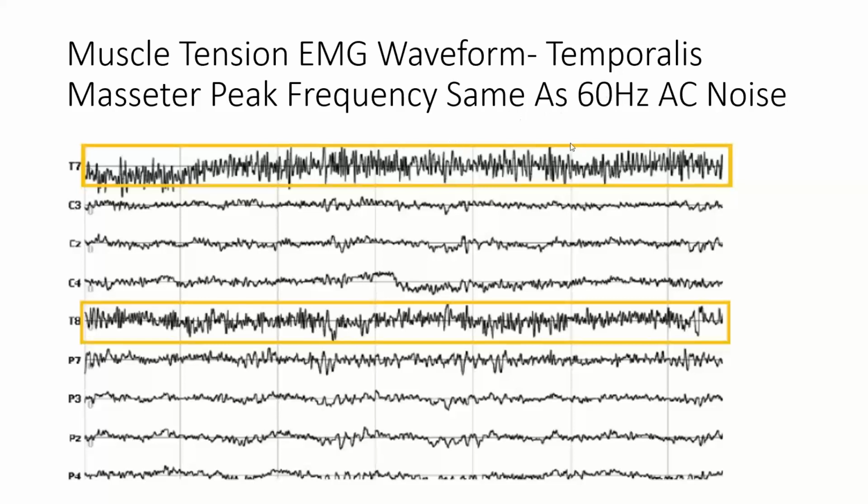And that's probably what we've got here because it's in the temporal regions. Most of the masseter muscle, the majority and the most intense part of it, shows up at the temporal region, the temporalis muscles. And it's below the temporalis, but it comes up through that area. Signals travel, something that we have to keep in mind.